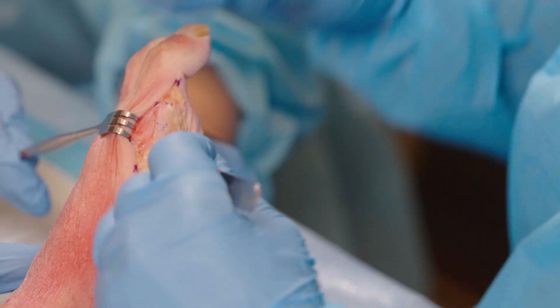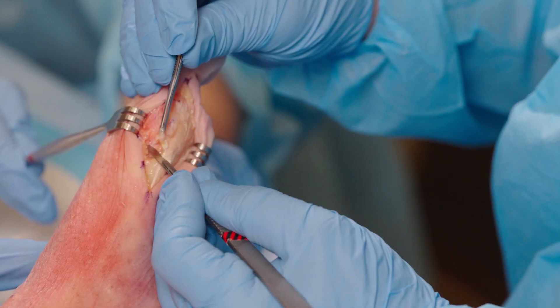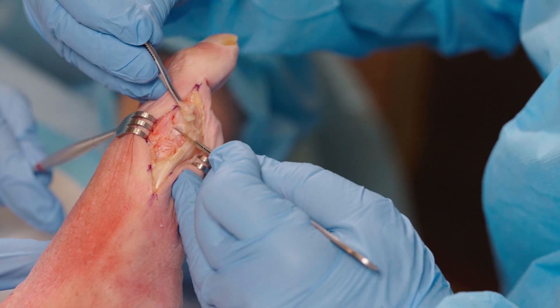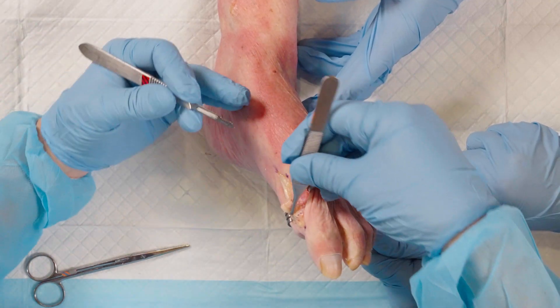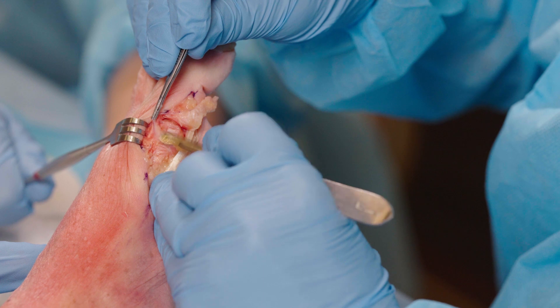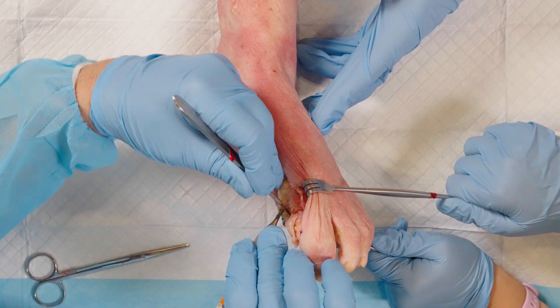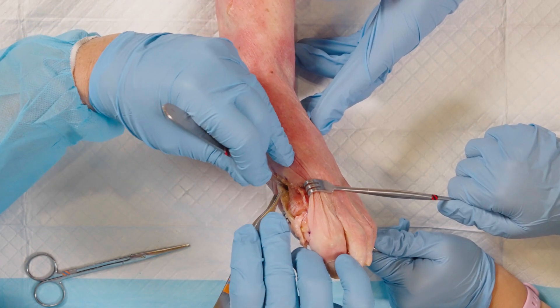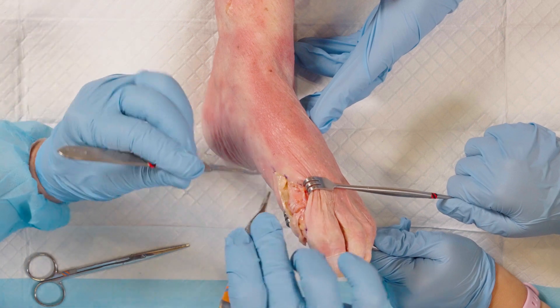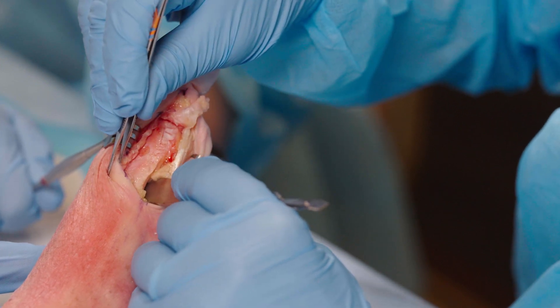I take it and we free up the periosteum and cut it distally to expose the metatarsal head. We leave the tissue intact to the phalanx for later repair. We will then come and free up the periosteum from the dorsal aspect of the metatarsal going proximally for screw placement and then plantarly, we free it up to the full extent of the osteotomy. For bigger deformities, I make my incision all the way back to the plantar flare of the metatarsal. This will ensure later stability of the osteotomy.